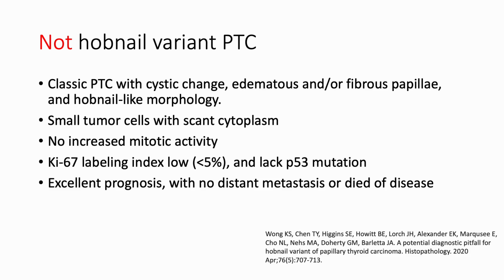PTC with hobnail-like morphology are often small tumors with a fibrous capsule. The tumor cells are small with scant cytoplasm. No significant cytologic atypia or increased mitotic activity is present. Ki67 labeling is low. No p53 mutation is detected. These hobnail-like PTCs are associated with excellent prognosis, same as other classic variant of PTC. It is important that we do not mistake classic PTC with hobnail-like morphology as hobnail variant of PTC.